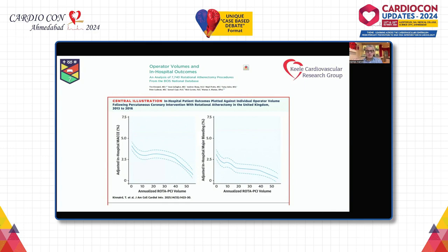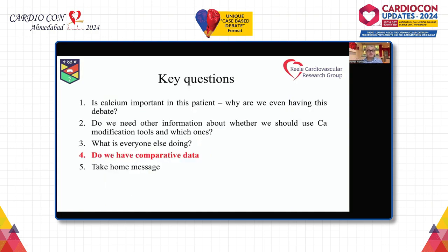So I think that's one of the things that we need to think about: ease of use. Yes, there are many experienced people, and I'm sure the protagonists are very experienced, but many operators simply don't do enough cases to get optimal results, and lithotripsy is probably better in these operators.